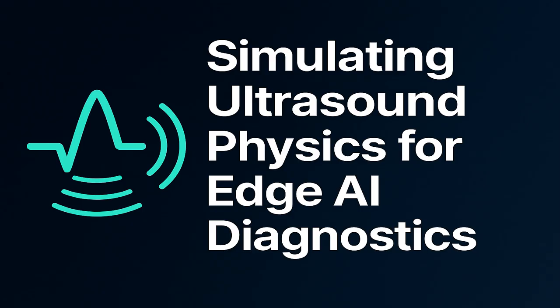But the second pillar of loss, that one is critically tied to frequency. It's frequency dependent attenuation. And this is the thermal and viscous loss of energy that's actually absorbed by the tissue itself. Right. This loss is exponential. And it's why choosing the right transducer frequency is basically the first decision a radiologist makes. I see. The pressure wave decays exponentially as it travels. The equation is based on e^(-αz). The key here is that the attenuation coefficient alpha is directly proportional to frequency. And the standard value for soft tissue is often cited as 0.5 dB/(cm·MHz). That's the one. And this relationship is the core trade-off in all of ultrasound imaging.